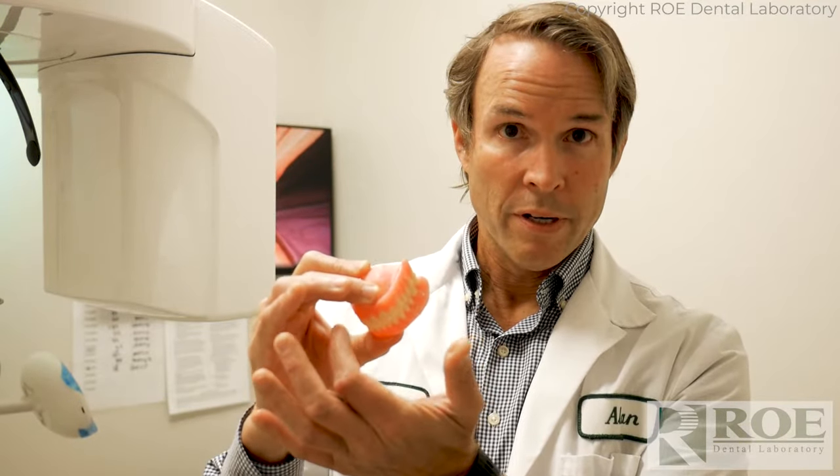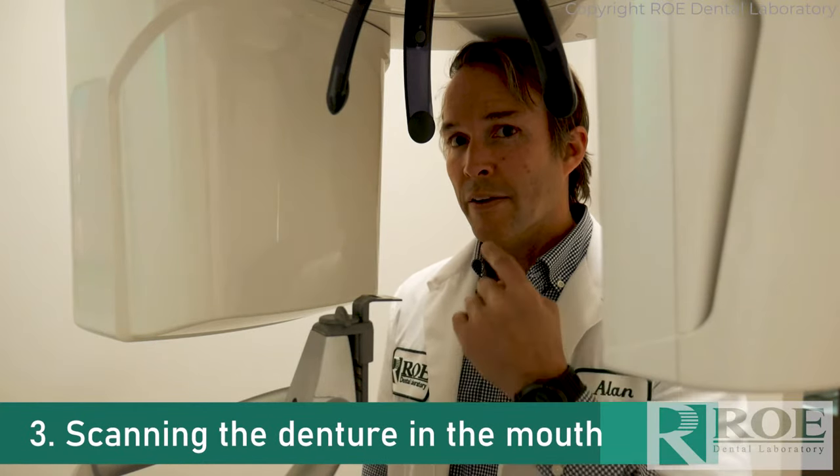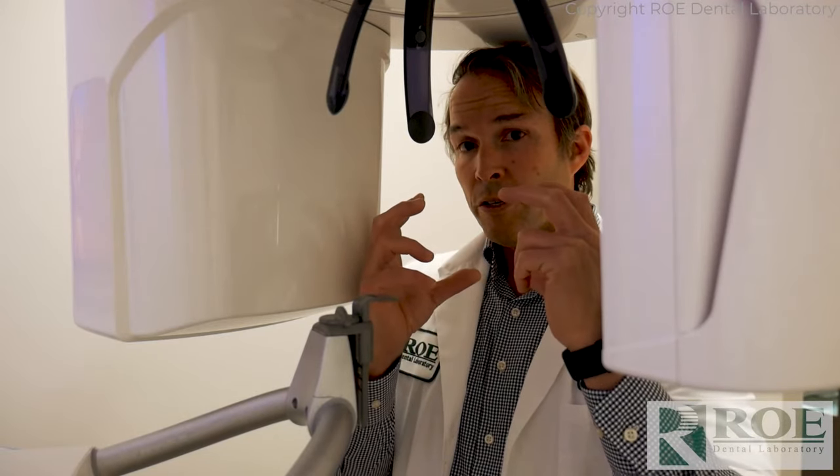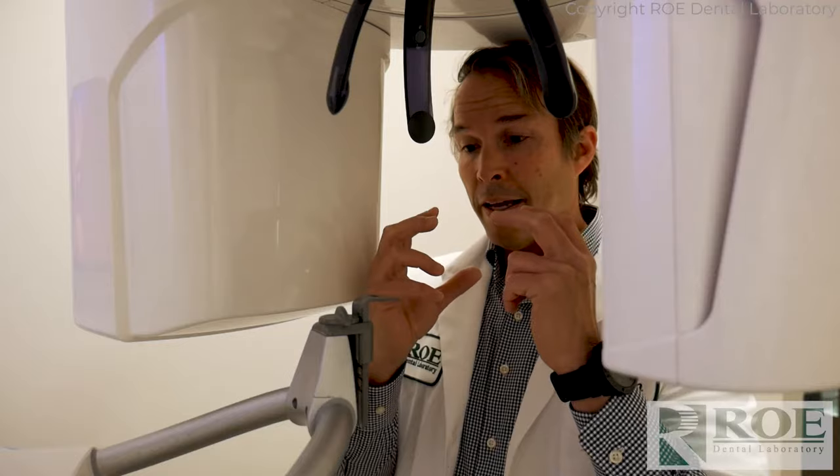Many patients are doubly edentulous — upper denture and lower denture. On those cases we do something a little different: we use both dentures, 12 markers total — six on the upper, six on the lower — and we do a dual scan, which is actually three scans. The first scan is with both dentures in the mouth in occlusion. The second scan is of the appliances by themselves individually. When taking a CT scan for an edentulous patient, always have the teeth together biting — never use cotton rolls, a stick bite, or a scan bite to separate them. We want the denture loaded in full occlusion so we can plan the case knowing it is contacting tissue in occlusion.